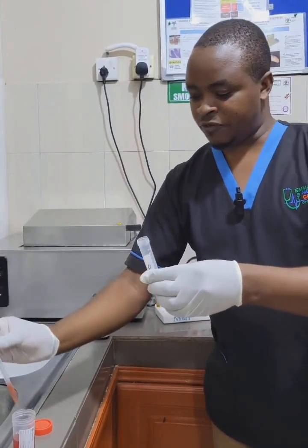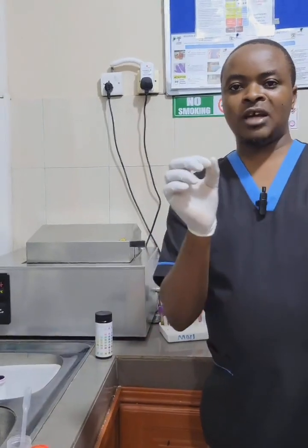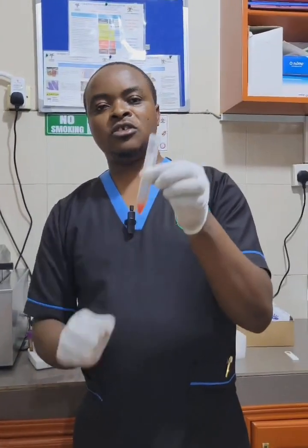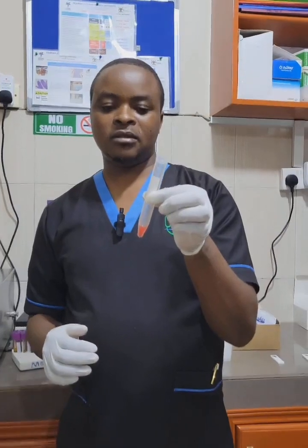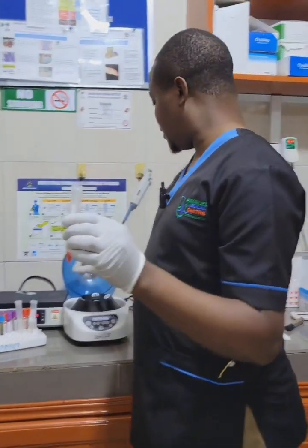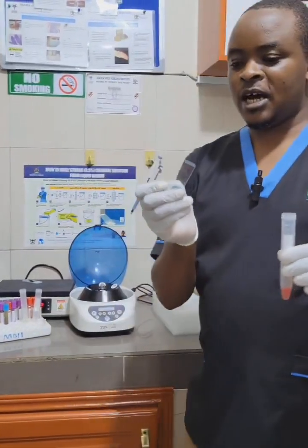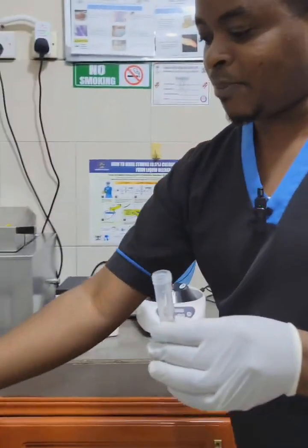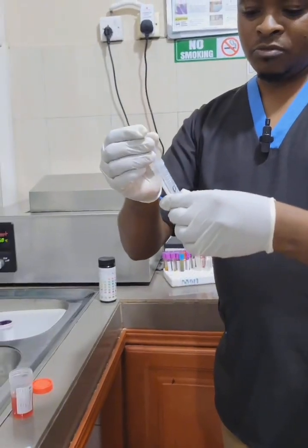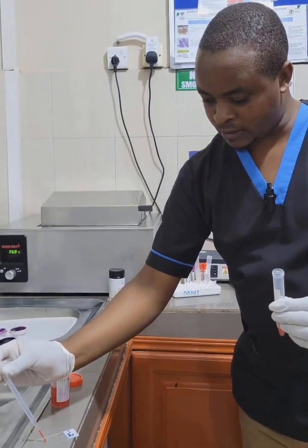So after pipetting off the supernatant, using your thumb finger, you tap on the tube to mix the sediment. After mixing the sediment, you obtain a microscope slide and put your sample. You can use the pasteur pipette to pipette part of the sediment on the microscope slide.